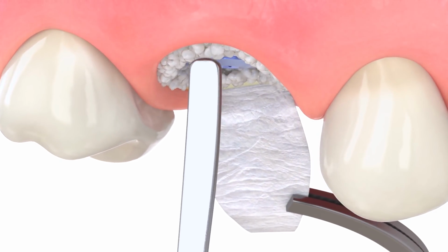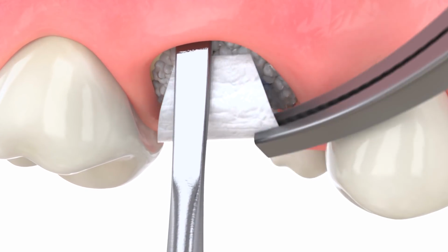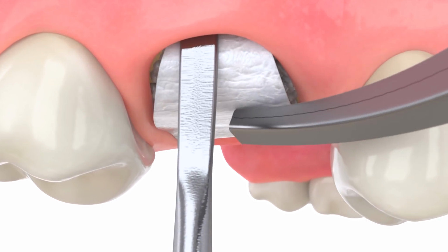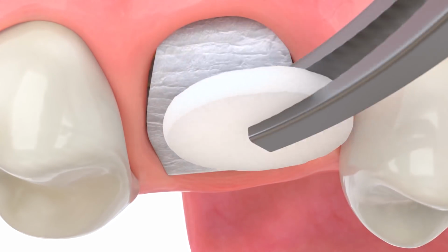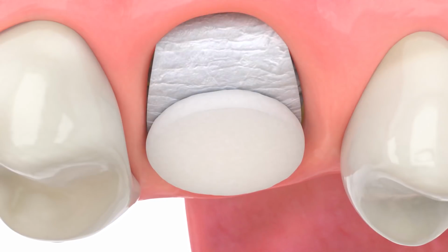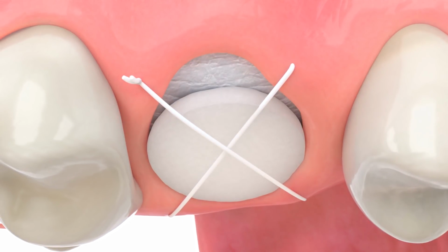Once the Mineros has been packed into the voids around the implant, cover the site with the Memlock membrane. Place a collagen plug on top of the membrane and suture it into place to stabilize and protect the membrane during healing.